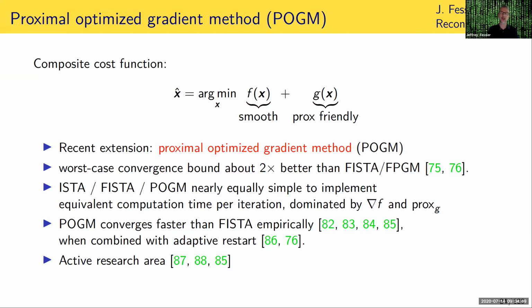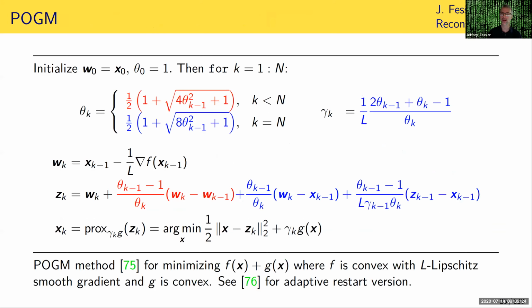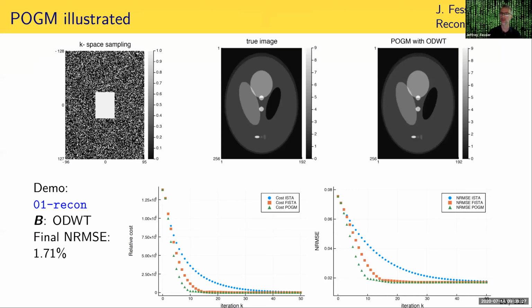There is a method called proximal averaging, where if you have multiple non-smooth terms, each update uses just one of those terms, and you cycle through the different terms, or you apply them individually and then take the average. The average of a set of proximal operators is in general not the same as the proximal operator of the sum of those functions, but people have made inroads into some convergence theory, even though you're applying those non-smooth terms one at a time. So let me leave it at that as my initial answer, and if you have more questions about that, we could follow up later.